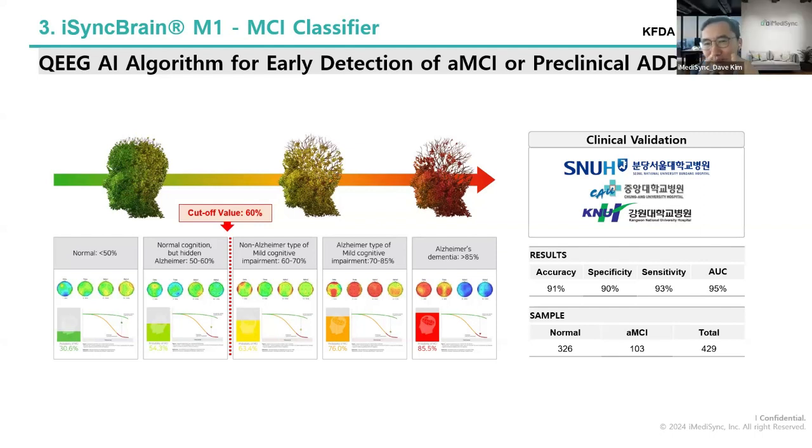What kind of EEG pattern makes this number is very difficult to find from the current AI model. So the current trend is making an explainable AI model. Using that model, we can associate this number with, for example, the slowing of alpha rhythm or spreading of the theta rhythm in the frontal temporal area.